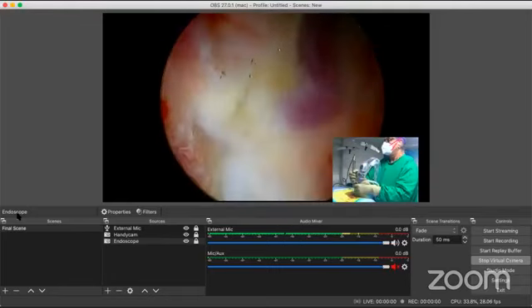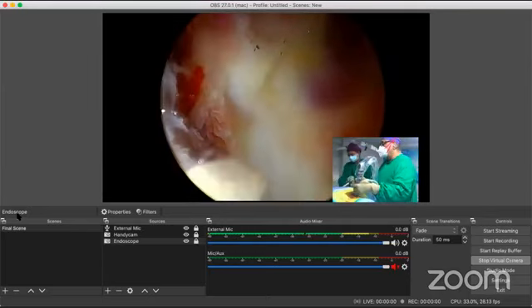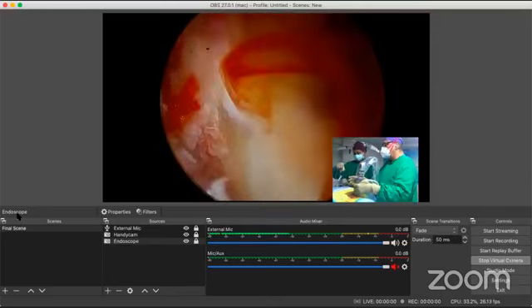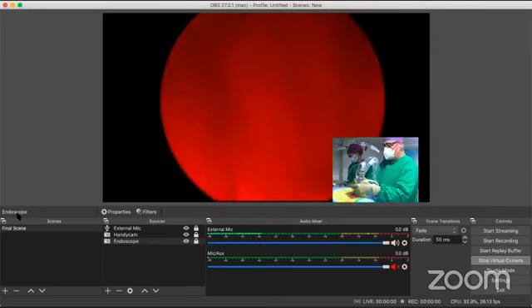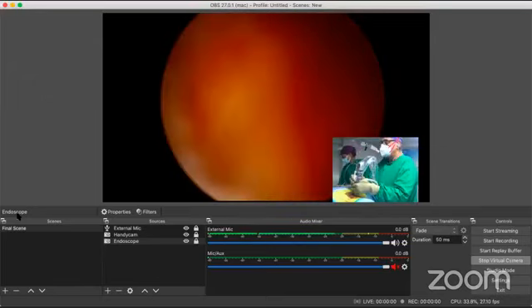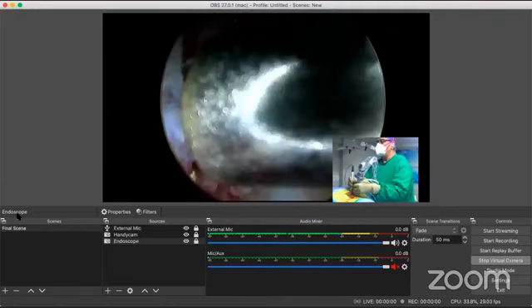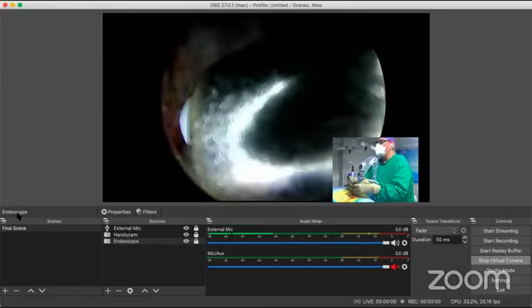Can we have a stop right now to our burring, and can I take a number 2 RF, please? Code 1. They're changing the fluid bottle. Thank you. And now I'll try and do a little bleeding control. Fire the blue, please. See, all the red marrow.